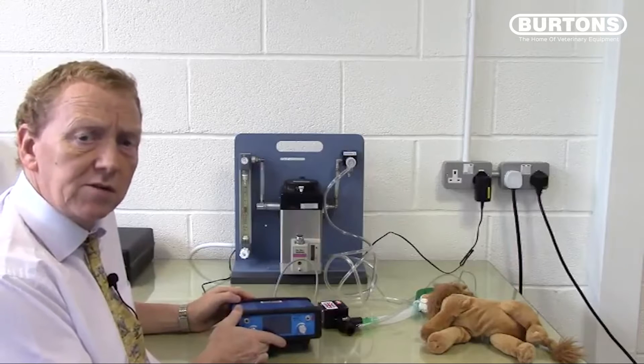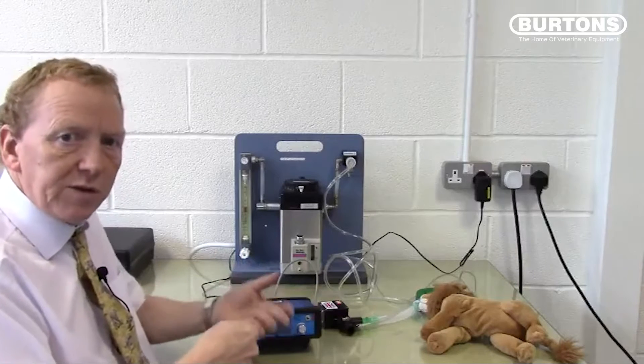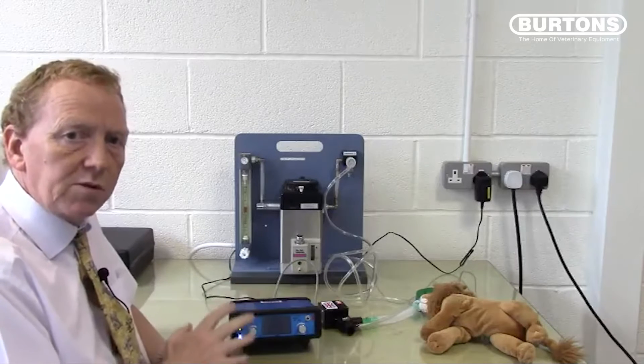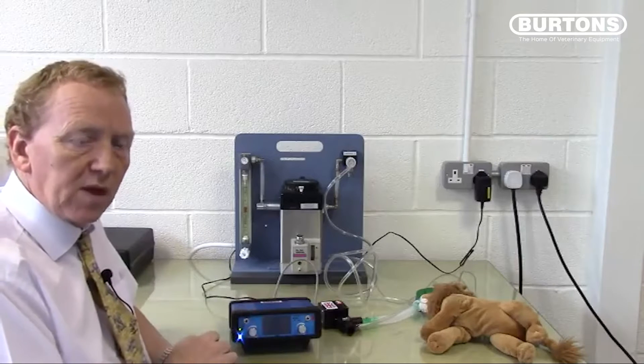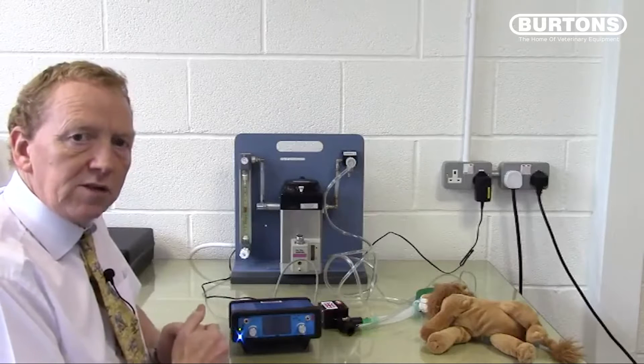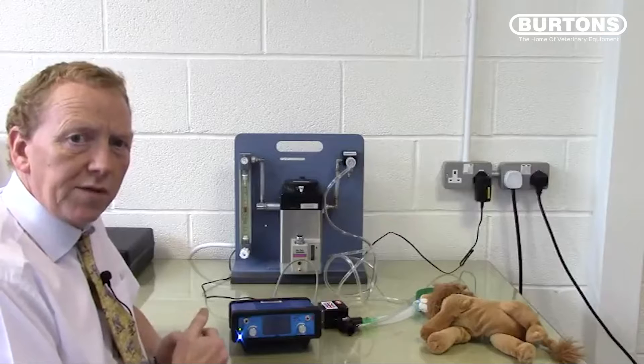In the past, to ventilate a patient on a T-piece, you would occlude the valve at the bag and squeeze it with your hand to inflate the patient. The SAVO4 now does that for you in an automatic and very controlled way. This video is designed to show you the features and some of the user setup options and to familiarise yourself with the SAVO4.